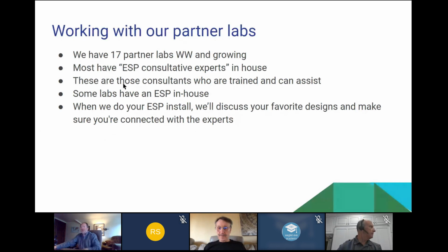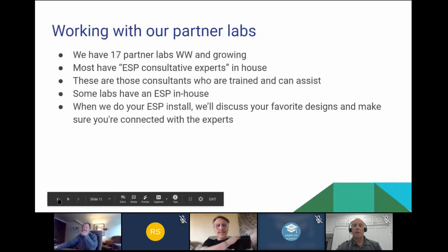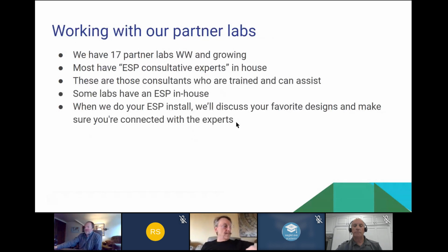So the vast majority of labs have somebody on staff who can work with you directly on your ESP questions and talk about what you see and what you should consider. Some of the labs even have an ESP in-house, so that obviously helps them get more familiar with it. Sorry for this jumping around. And when we do the install, we'll discuss your favorite designs and make sure you're connected with the experts.